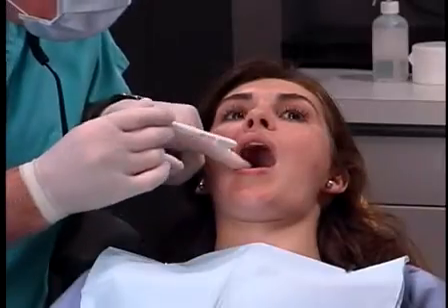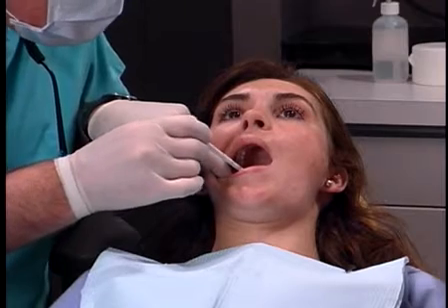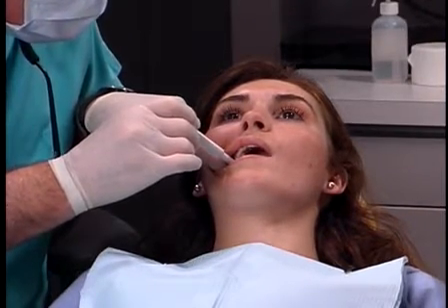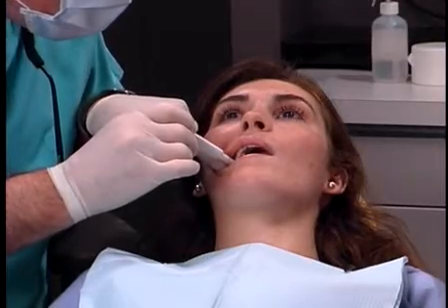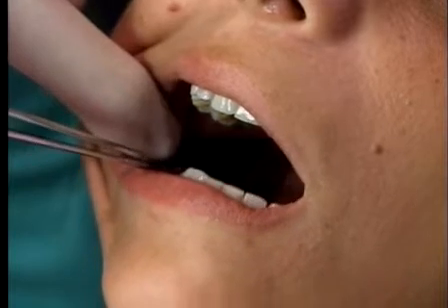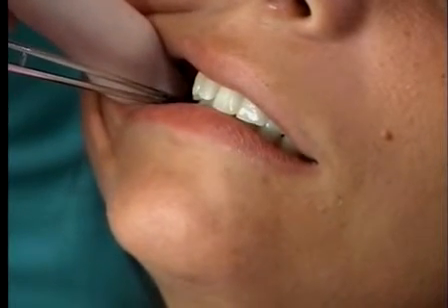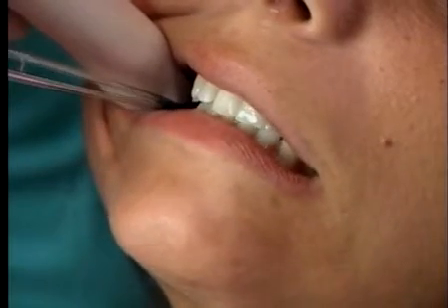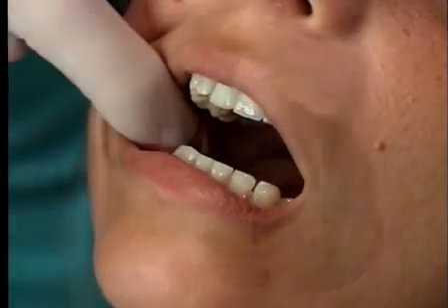An alternative to the cue stick is to use the tooth sleuth. This device can be very specifically located on a particular cusp, and having the patient bite can oftentimes reproduce the chief complaint. Marking ribbon can be placed between the biting surfaces of the mandibular and maxillary teeth, and by having the patient move into different working and balancing positions, we can oftentimes mark a prematurity.